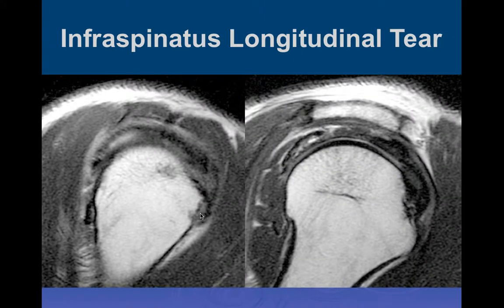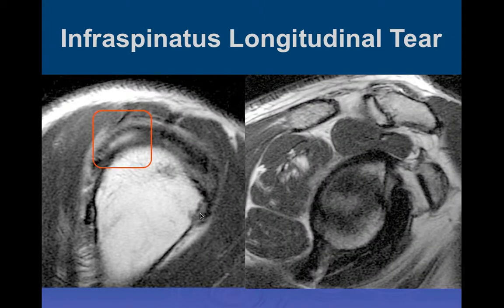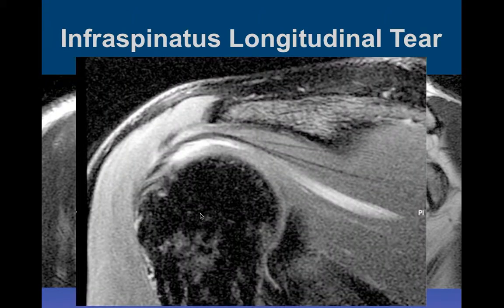Here's one with low signal intensity due to acute hemorrhage within the cyst of the muscle-tendon tear. And this is just another longitudinal tear which you can follow. This one is into the infraspinatus.